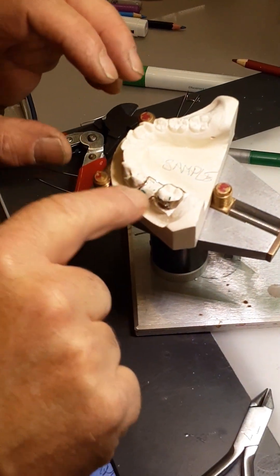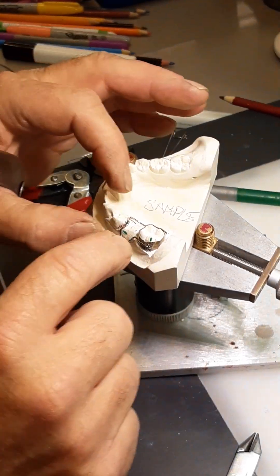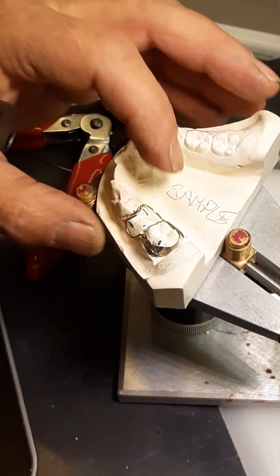This is the loop for the band loop space maintainer — this is what we want to end up with. This is going to get spot welded onto the band and then we're going to solder it.